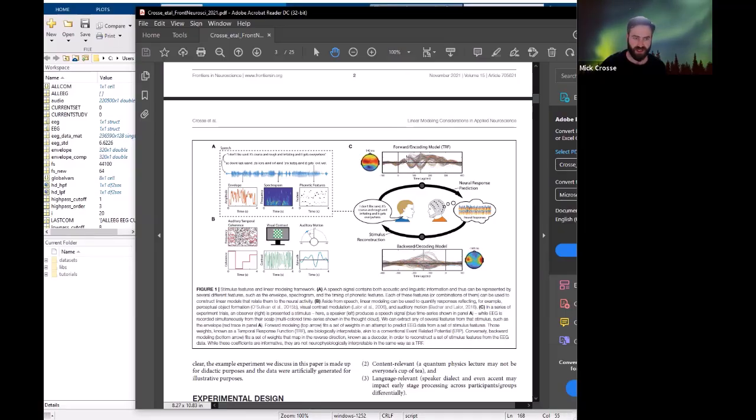The coefficients of our model at every channel, which is what you're seeing here, should look like a neural response essentially. If they're doing a good job at predicting new data, then they'll probably look like an ERP to some degree. You'll see some of the typical components that you'd see in an auditory ERP, if everything is working correctly.